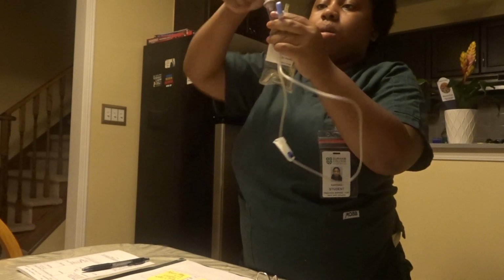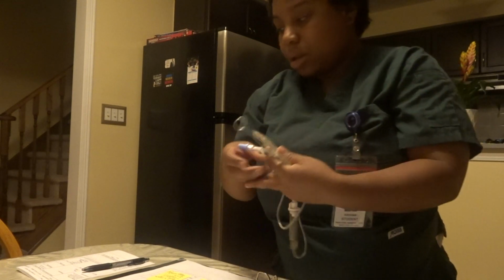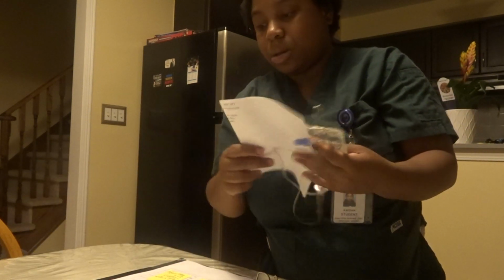Put that there. And then I'm gonna just put the medication in. And there we are. So after doing that, I'm then gonna gather this, my worksheet, along with lips, and then I'm going to go to the patient's room. This is right over here.